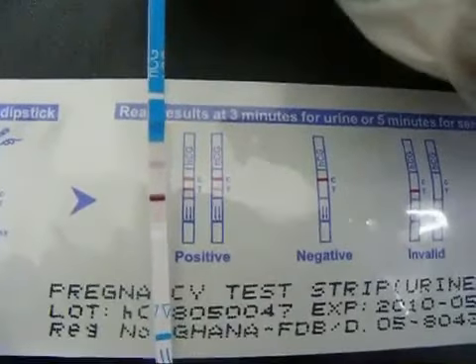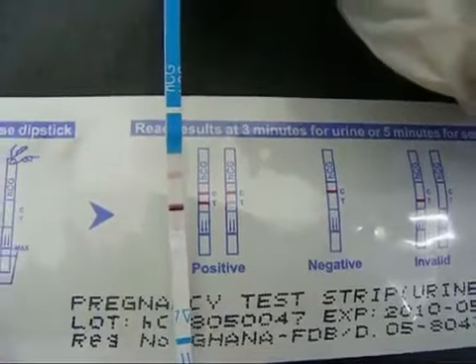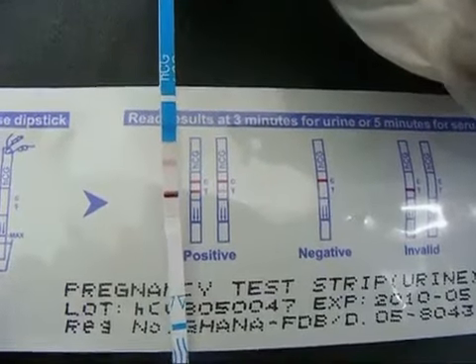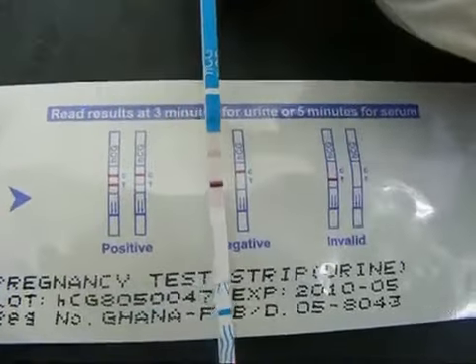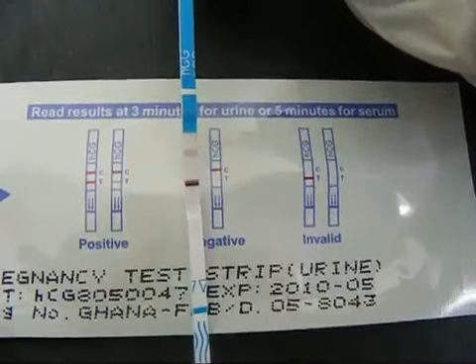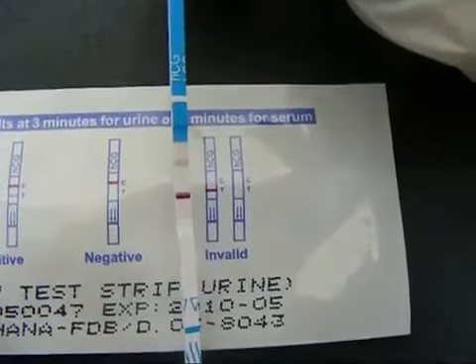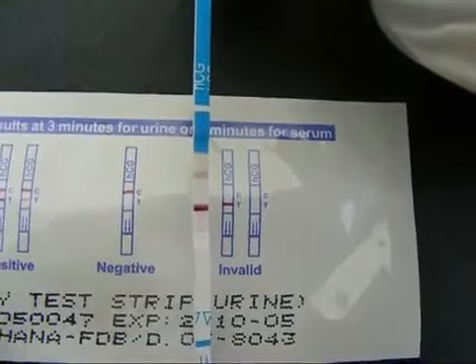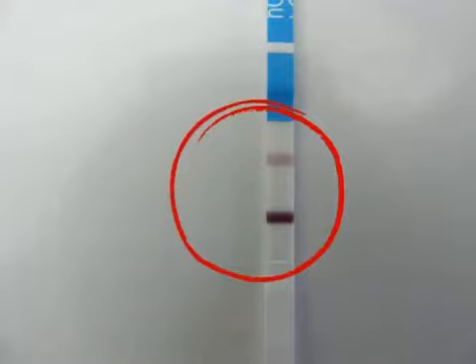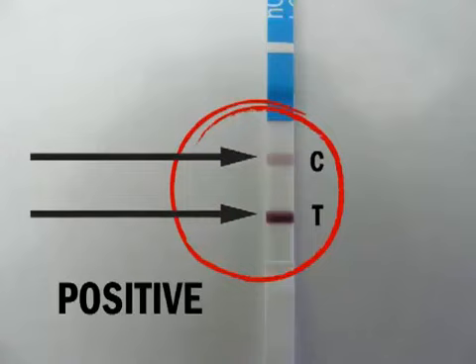For a positive result, two distinct red lines appear. One line should be in the control region C, and another line should be in the test region T. Note: the intensity of the red color in the test region T will vary depending on the concentration of hCG present in the specimen. Therefore, any shade of red in the test region T should be considered positive.